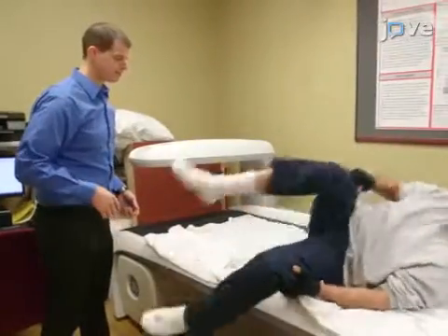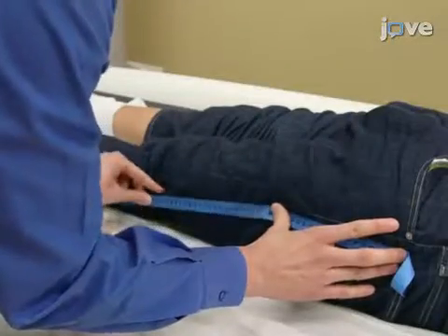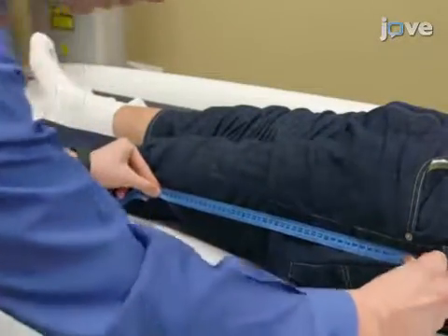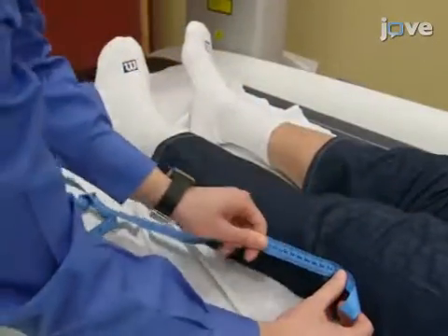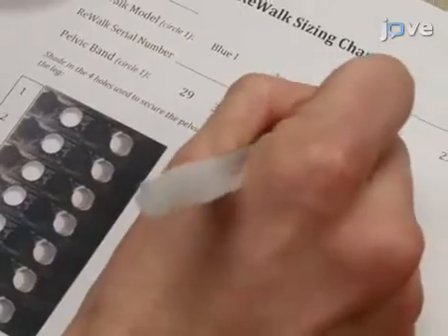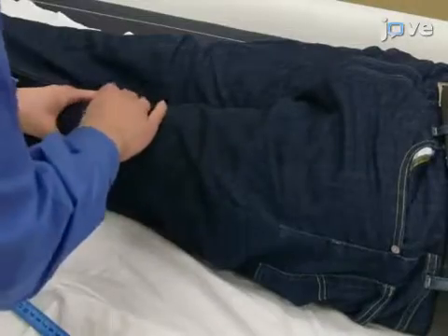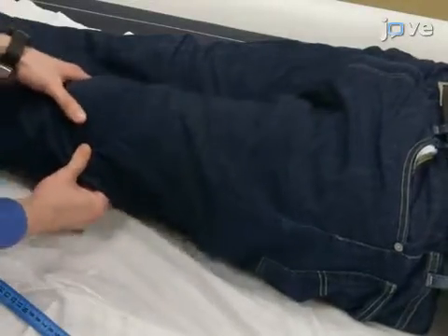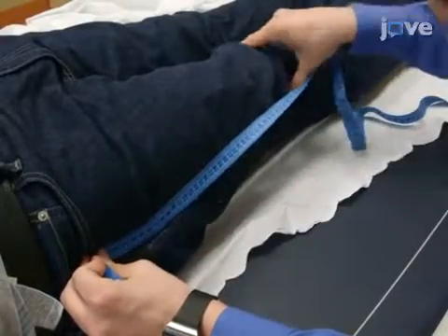Begin by placing the participant in the supine position. Use a flexible tape measure to determine the pelvic width, upper leg length, as well as lower leg length, and record in centimeters. Measure the upper leg length from the most prominent point of the greater trochanter of the hip to the knee joint line. Measure the other limb in the same manner and record any discrepancies in limb length.